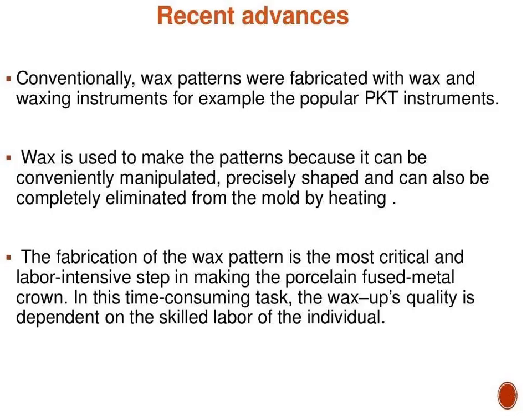The topic which we are going to discuss is recent advances in dental waxes. To begin with, conventionally, wax patterns were fabricated with wax and waxing instruments, for example, the most popular PKT instruments. Wax is used to make the patterns because it can be conveniently manipulated, precisely shaped, and can also be completely eliminated from the mold by heating.